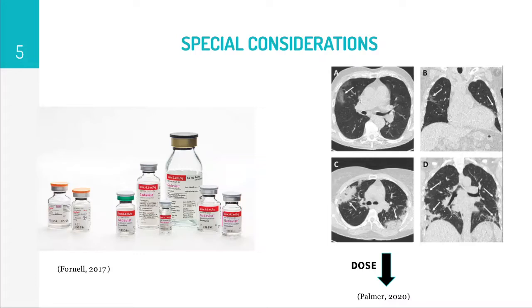Currently, the alternatives to iodinated contrast media include carbon dioxide, gadolinium, and dilute iodinated contrast media, which each have their own limitations and complications. If one of these alternatives cannot be used for any reason, the exam must be completed without contrast, or other exams may be done. For example, another type of exam that can be performed is a low-dose CT scan, which does not use any type of contrast media at all.